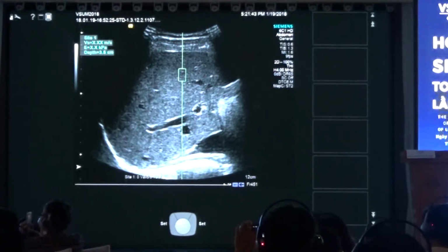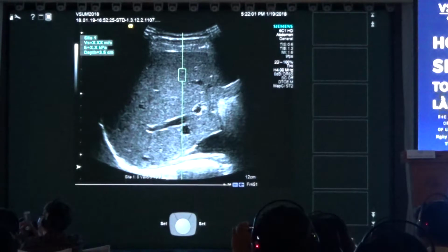I've shown how fast that might work, and after a while the touch might even be faster than what I've been doing, and it does not take a long time. It takes 30 to 90 seconds to get 10 measurements. One question to the audience: is one good measurement worse than 10 bad measurements?